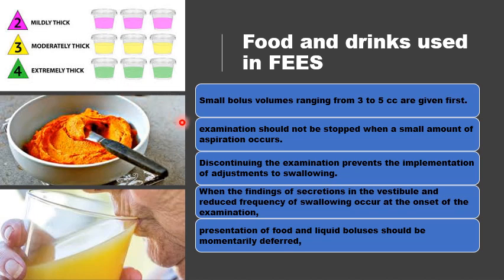If there is aspiration at any stage during this ascending order, the whole process should not be stopped altogether, because this would mean that the patient would lose the chance to identify what type of food and drink he can handle.